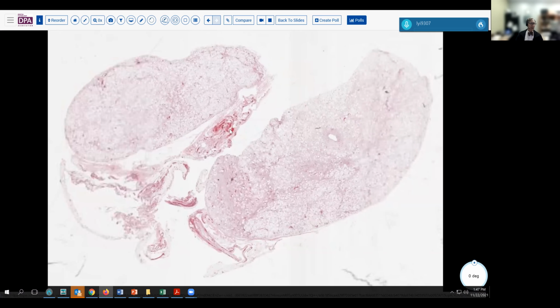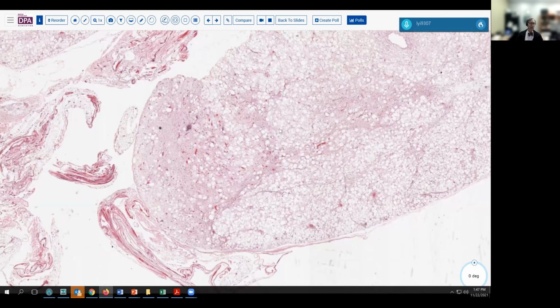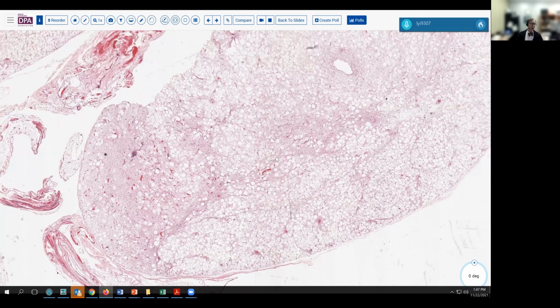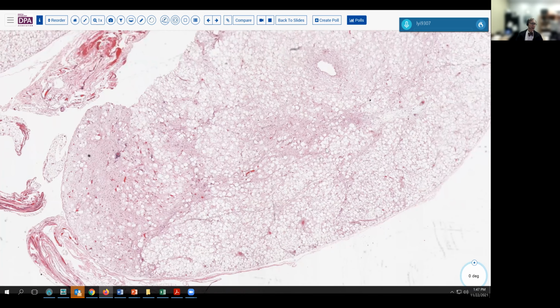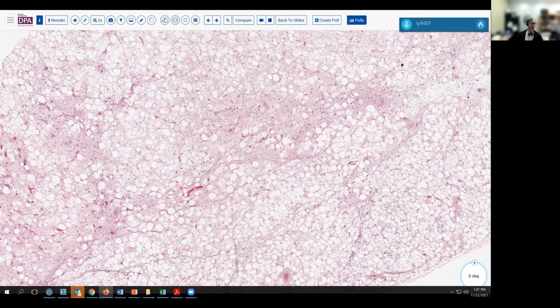So let's move on again to another low-grade tumor, here one in the fat. And we've, I think, done some videos on this type of lesion before, that a tumor like this might be a lipoma, might be a variant lipoma, or might be a well-differentiated liposarcoma / atypical lipomatous tumor, depending on, of course, the location and presentation and so forth.